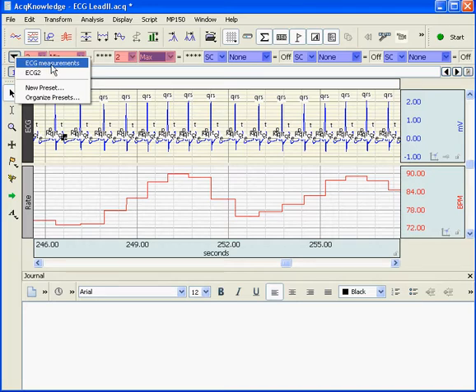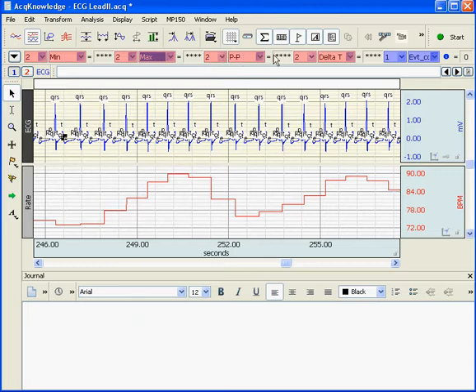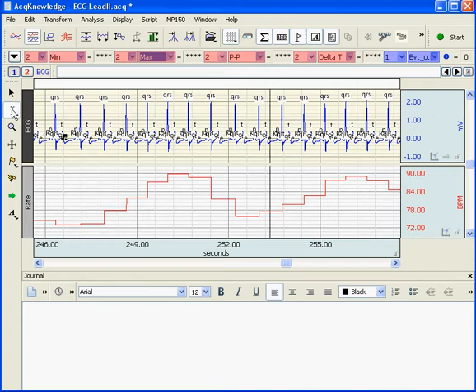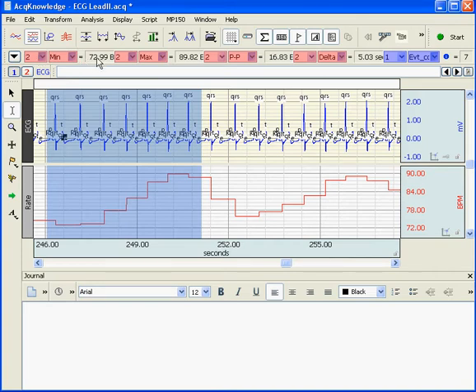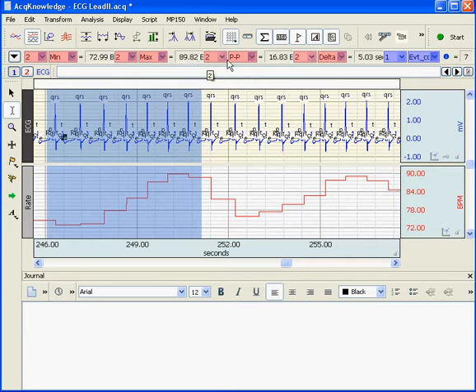I have already set one up for this particular demonstration and it is labeled ECG measurements. When I select that option, my measurements are all updated. And if I choose the I-beam highlight tool, I can highlight an area of data, and the results are displayed. So I am measuring the minimum value on channel 2, and it is 72.9 beats per minute. The maximum value from channel 2 is 89.8 beats per minute.